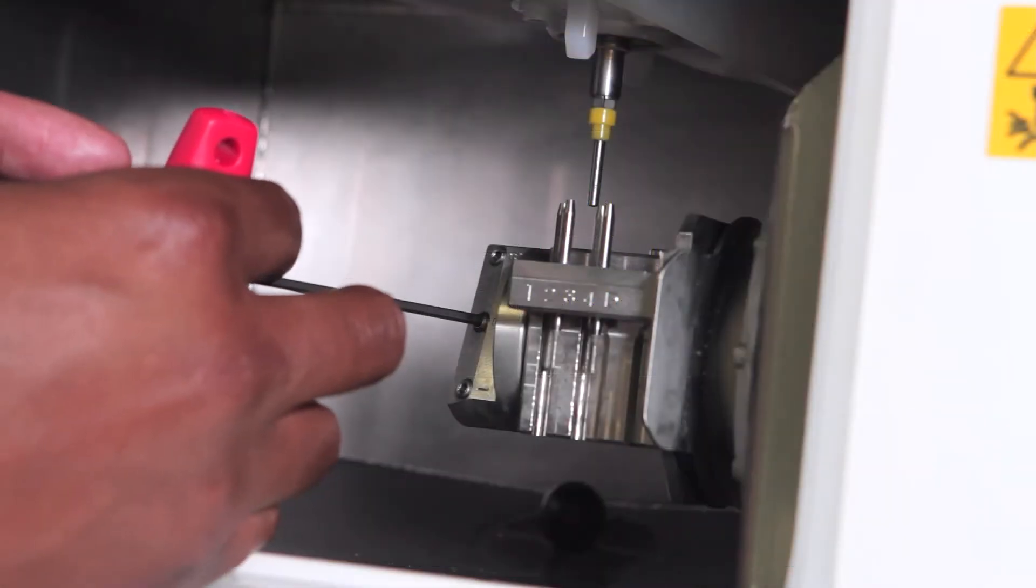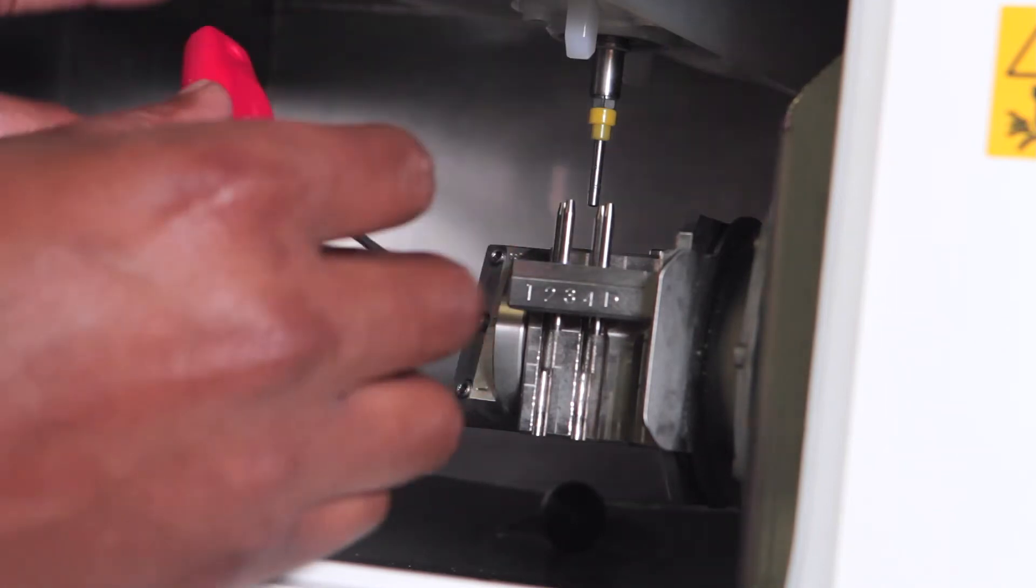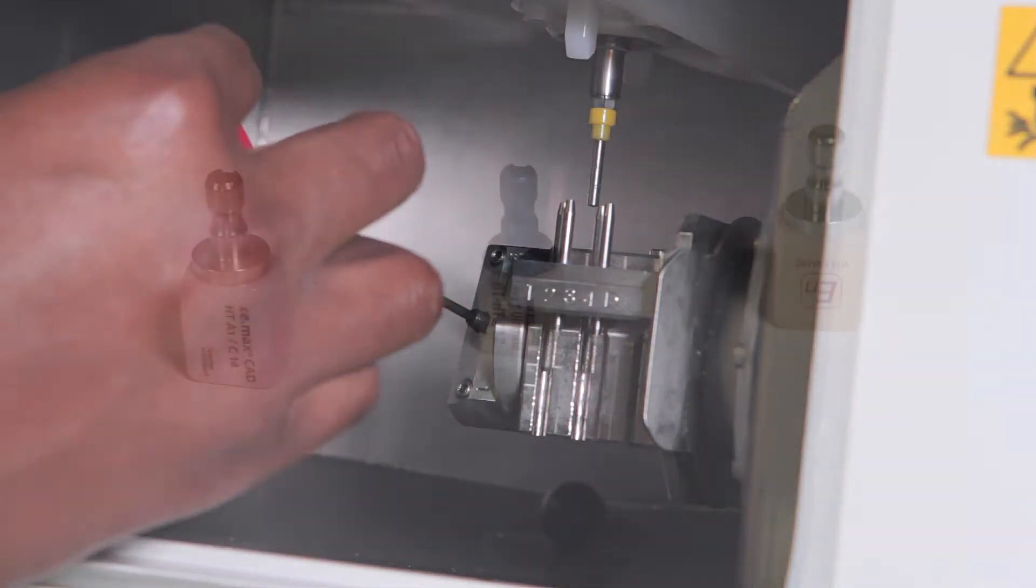To insert a pin type material into the multi-pin clamp, use the included hexagonal screwdriver to loosen the mounting screw in either of the 3-pin slots.